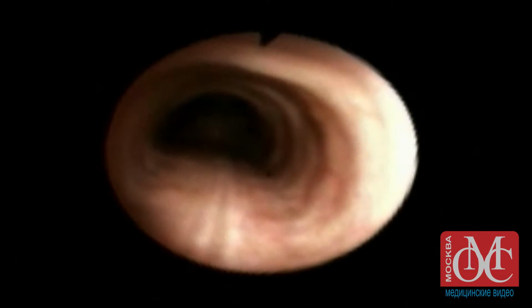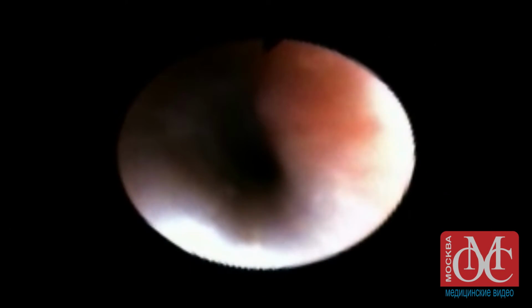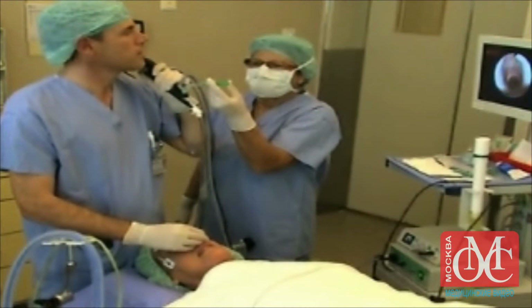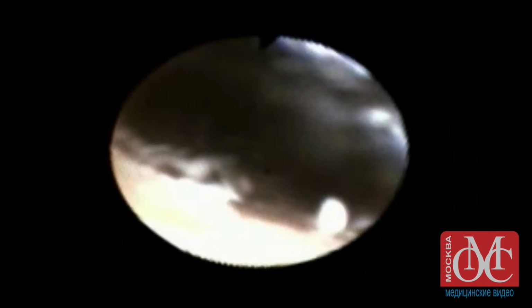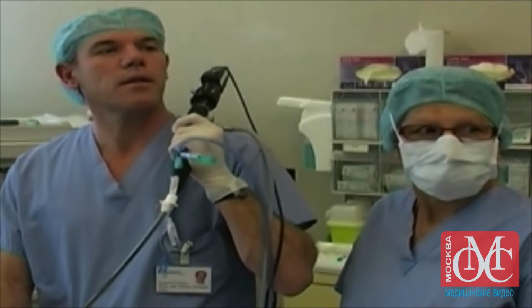Understanding the difference between the trachea with its rings and its posterior tracheal membrane and the esophagus is important because sometimes the scope is unintentionally advanced into the esophagus. Inject an additional 1 to 2 milliliters of local anesthetic through the channel of the fibroscope. This stimulus will induce a cough reflex and disperse the local anesthetic within the trachea. Make sure the fibroscope remains in the proximal part of the trachea, as only this area is anesthetized.